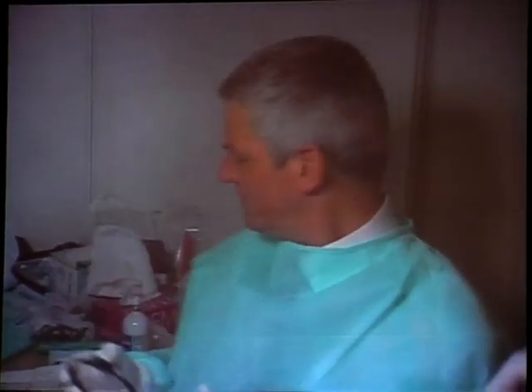Now we're going to do some soft tissue procedures with the diode lasers. We have two cases. One is depigmentation and a frenectomy, and the other case is depigmentation. We would like to show you all the lasers that are available at all the stalls here. So we have 5 lasers and we are going to do 5 parts. Both the quadrants of the depigmentation will be 2 different lasers in that one patient.